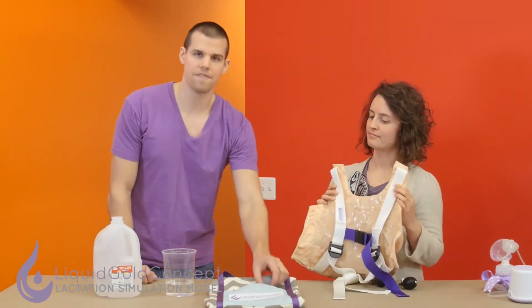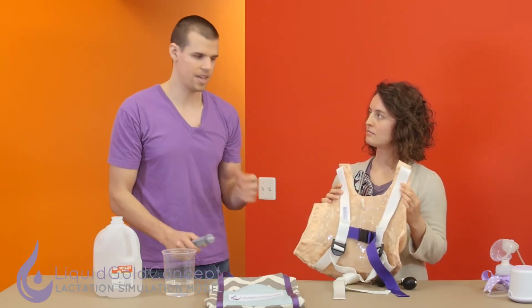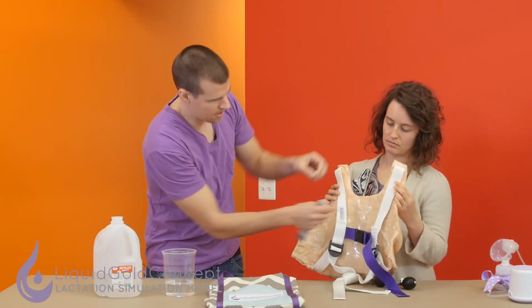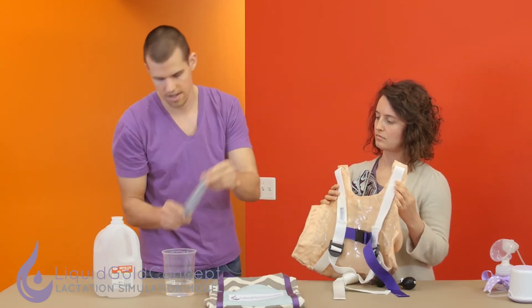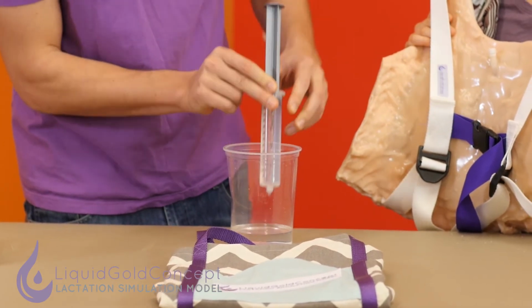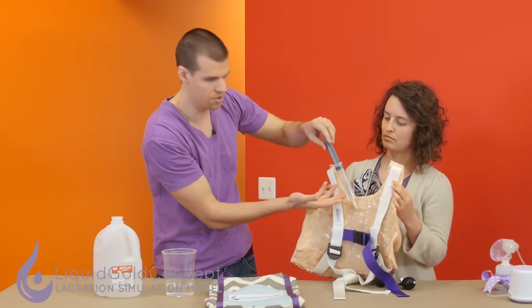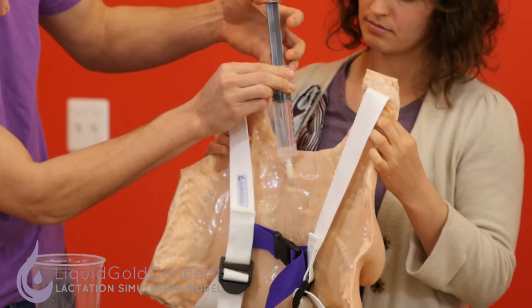So we're gonna start by filling the LSM with water so that when we practice our hand expression, we can simulate water or milk coming out. So to start, I'll take the top off of the fill tube. Then I'll take my syringe and I'll get about 60 milliliters of water. I'll connect it at the top, and this just uses a standard Luer lock, so in case you ever lose your syringe, it's pretty common and you can find one elsewhere.